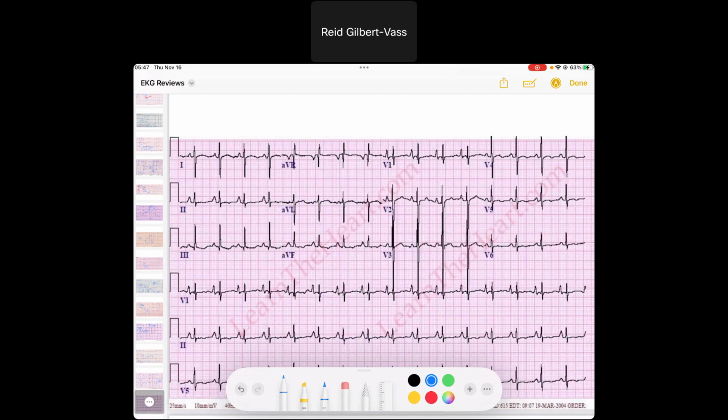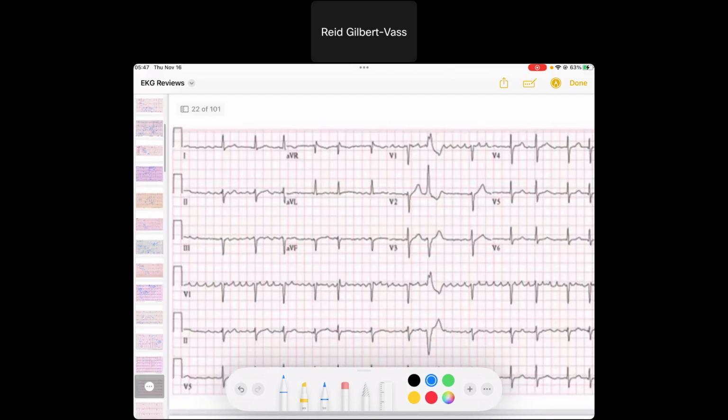Okay. We've already done this EKG, so we're going to pass.